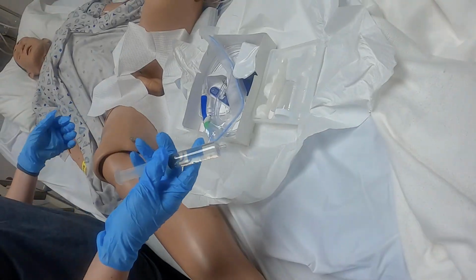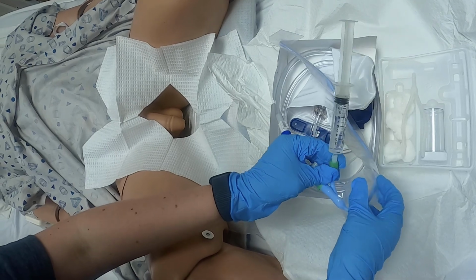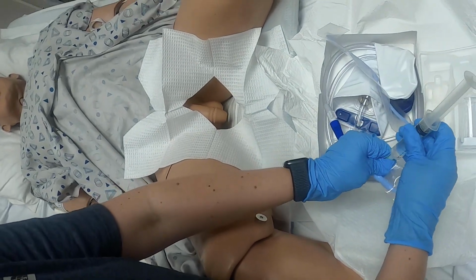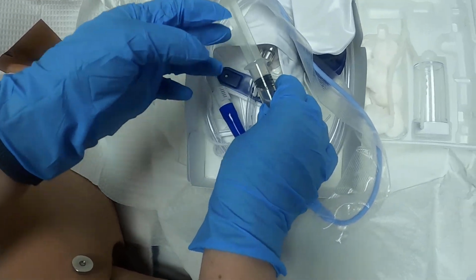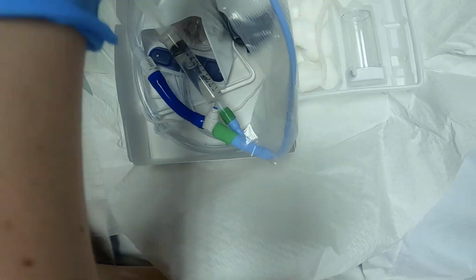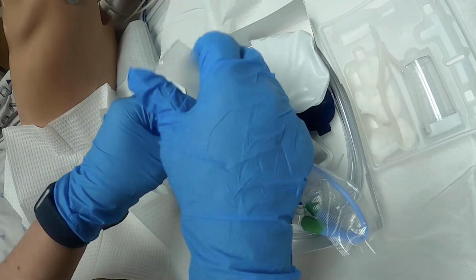Okay. All right, so now we're going to take the syringe and you're going to hook it up to the port so you make sure that you can inflate it. Okay, so now this is all hooked up. We're not going to ensure that the balloon inflates. However, you need to go ahead and ensure that this here is taken out of the plastic. Okay, as you can tell, this is fenestrated, so you have an easier time ripping this all open.